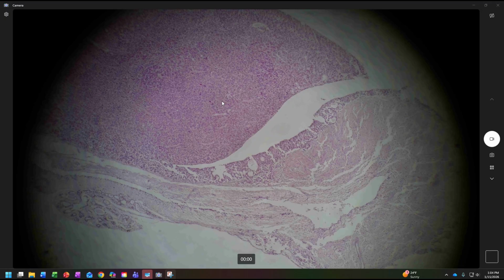All right. So this is the anterior pituitary, and this area here is the posterior pituitary. How do we know? This is the darker, grainy looking side. This is the lighter, wispier side, especially in this area here. It looks really wispy. Okay, so let's look at this. That's the 40x view. This is the 100x view. Let me get it zoomed in.